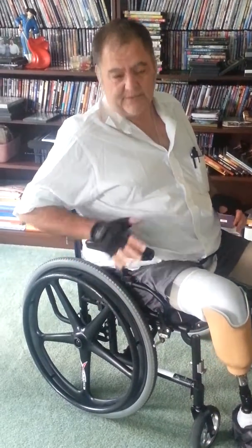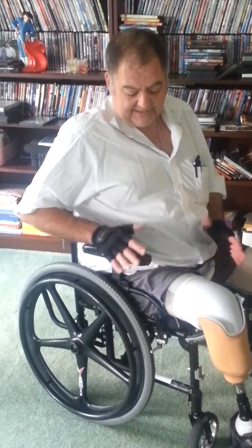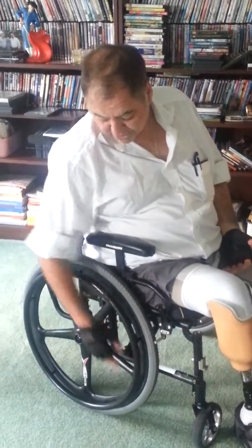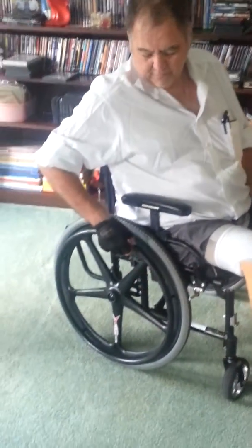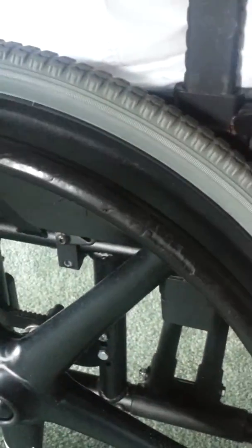One of the other things they're really good for, specifically with the wheelchair that I got, is that when I was getting this thing decked out, I got these push rims. They have a plasticky, a little bit rubbery coating on it, which seemed real good for holding on to, and I wouldn't need to wear gloves all the time. But over the course of time, as it's rubbed up against curbs and the sides of ramps, this plastic has got tore up.